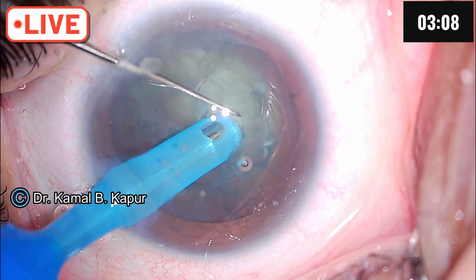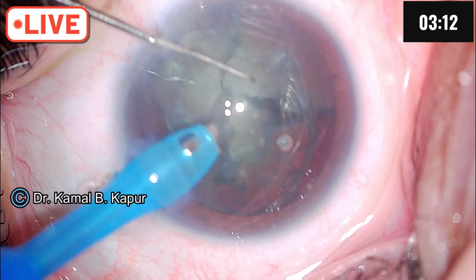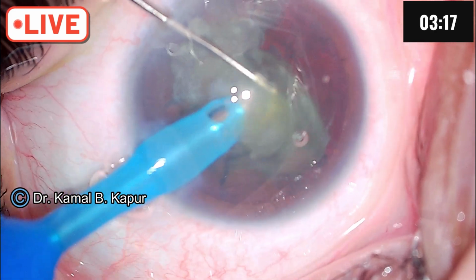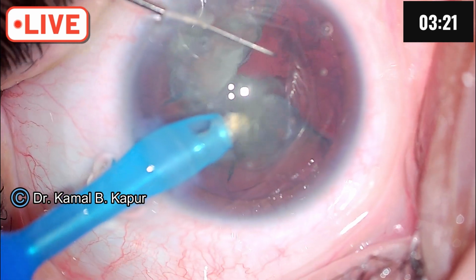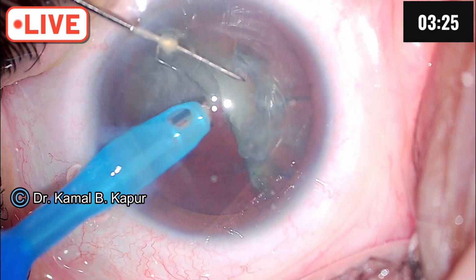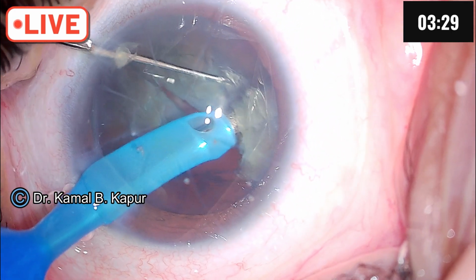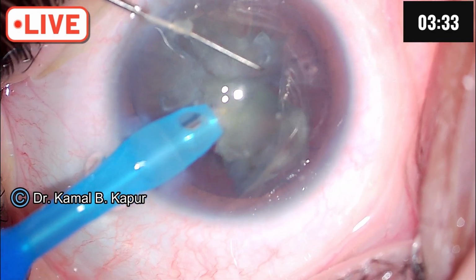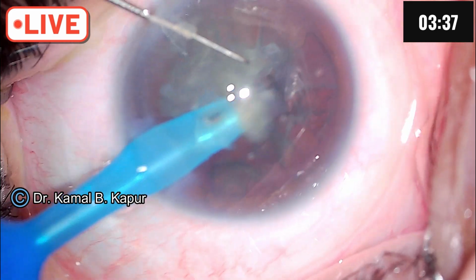So, we have got a chop. When I don't want the pressure to build up, I just dip my side port and cause some leak so that the IOP doesn't build up to cause stretching of the cuts, because as we all are aware, in patients who have post-RK, the corneal cuts have a unique ability to distend and open up.